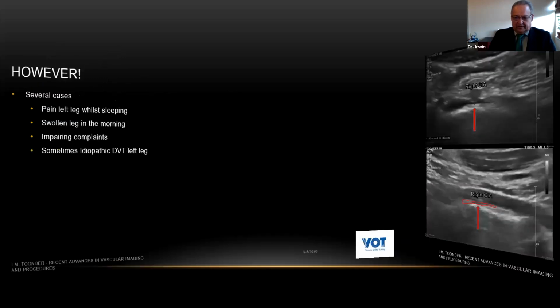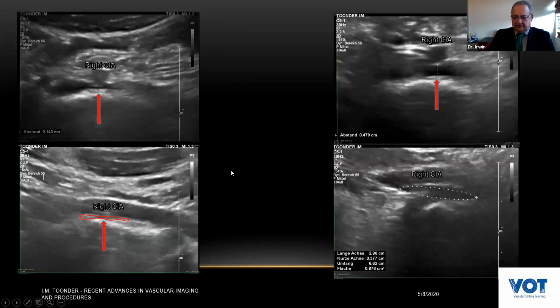And in these cases, and these are the unusual cases, where you're looking with the ultrasound, you can put them upright. Typically when they're supine, you can see the compression here of the right common iliac on the left common. You can see the flattened, nearly zero area of the lumen of the left common iliac. And when you put them upright, the distance is increased significantly from 0.1 to 0.5 approximately, and the area is not that bad. You say it's close to 1. Should I put a stent in here? We get these discussions, should we do it?